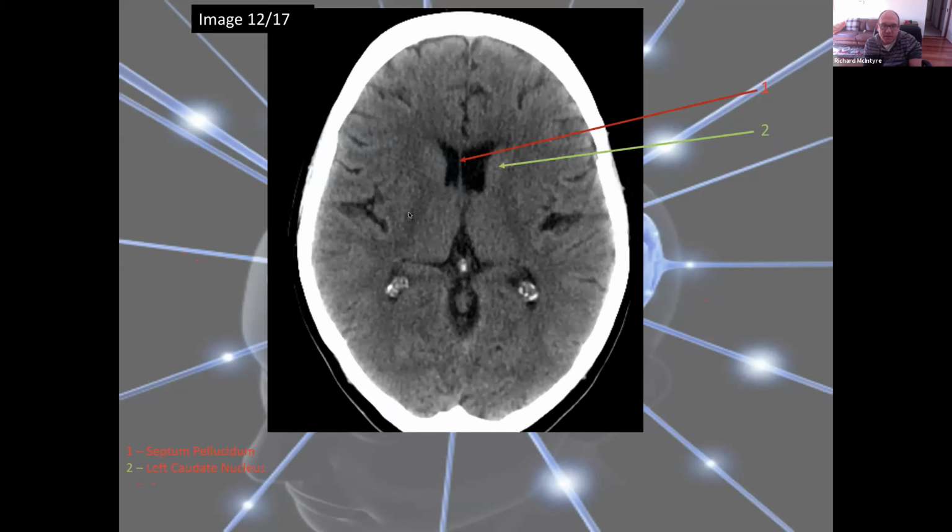This is interesting. This is choroid plexus. Okay, so it's calcified choroid plexus. So we know choroid plexus makes the CSF. Okay, this is calcified pineal gland. And of course, when it becomes calcified, as we grow older, then we start to see it. It absorbs the X-rays in CT, and we start to see it. Okay. Septum pellucidum, separating the left and right ventricle.